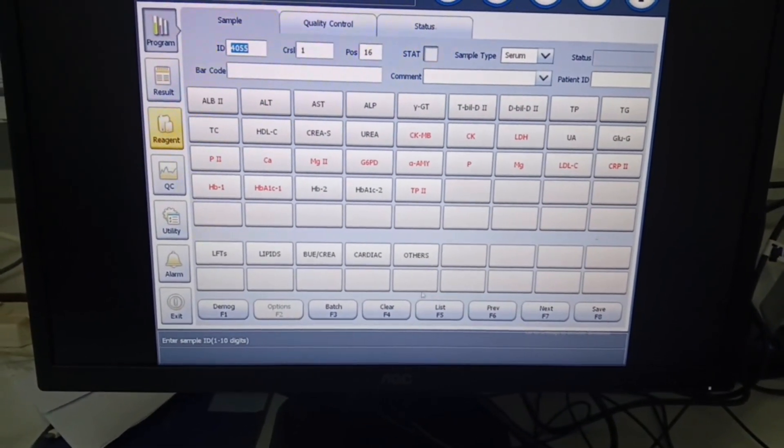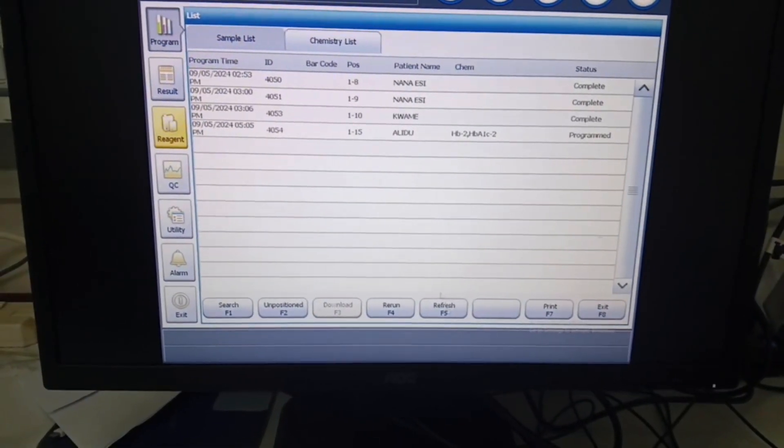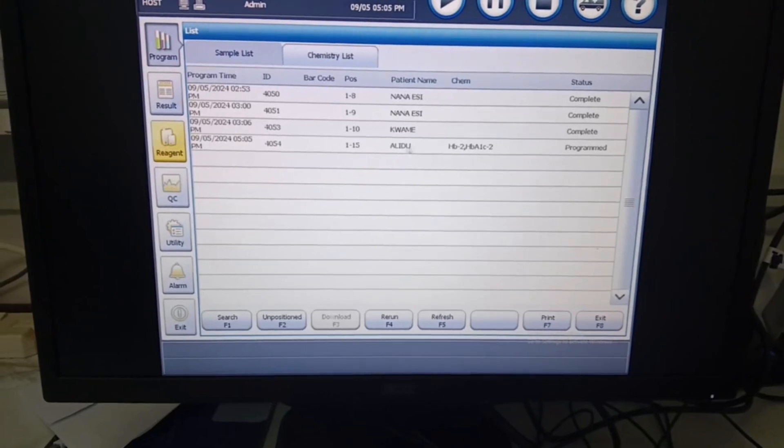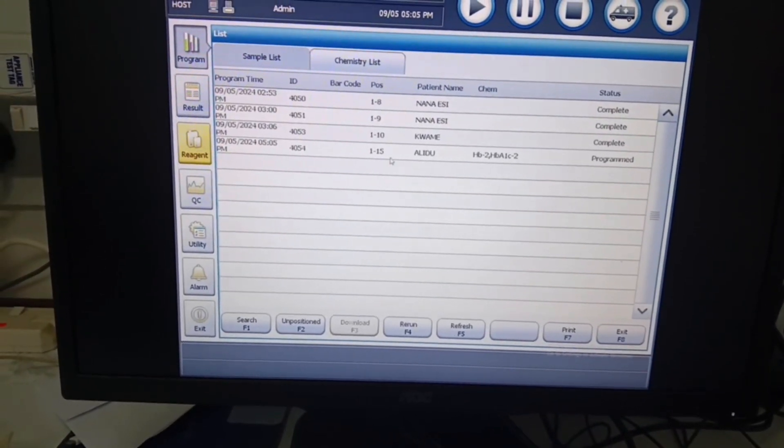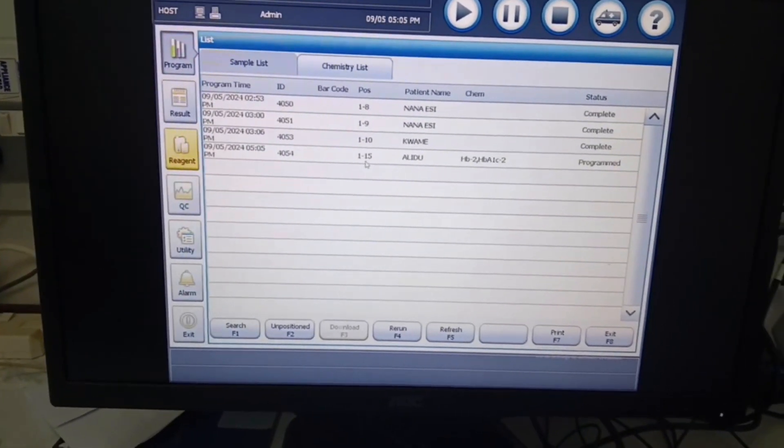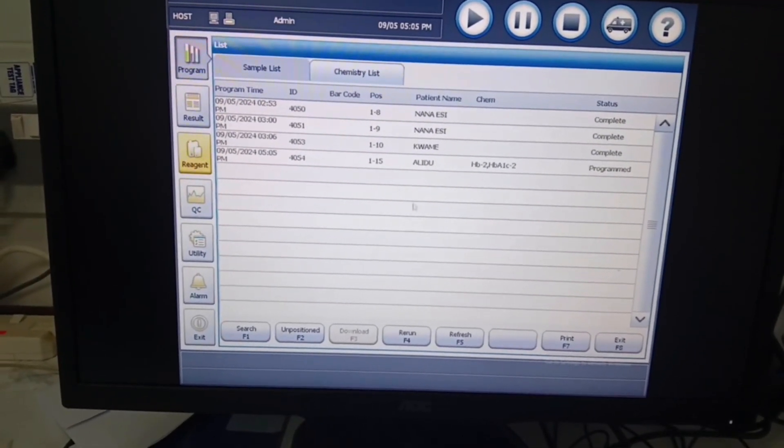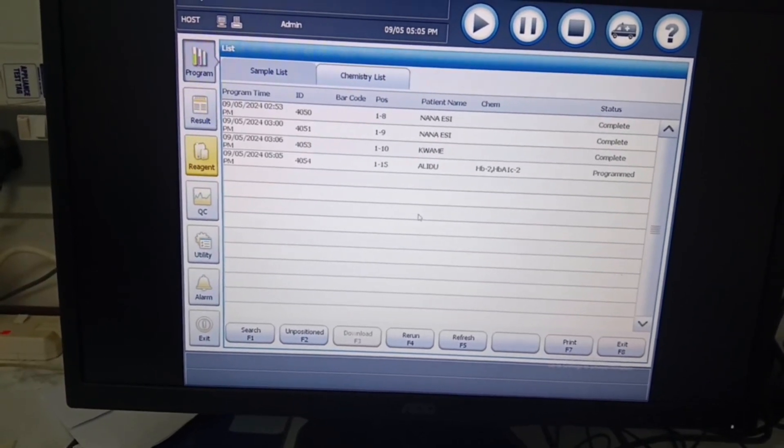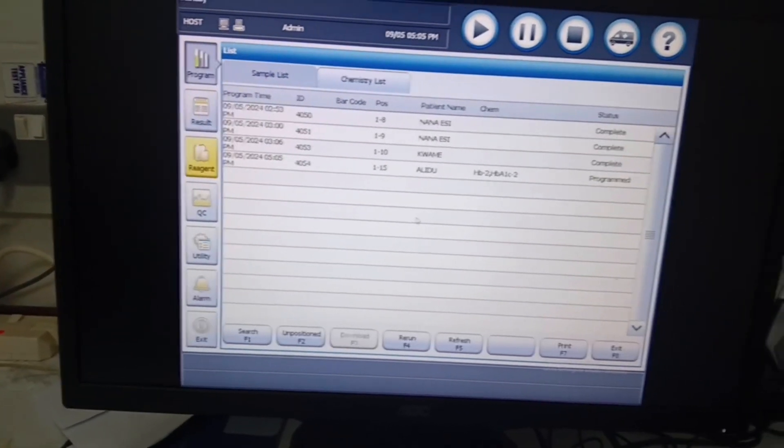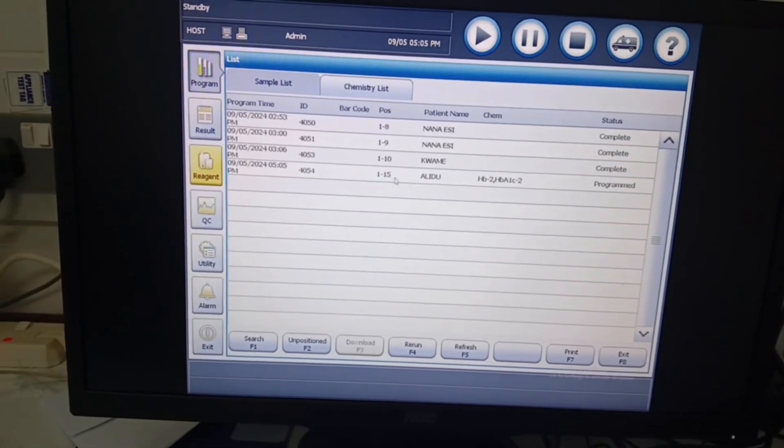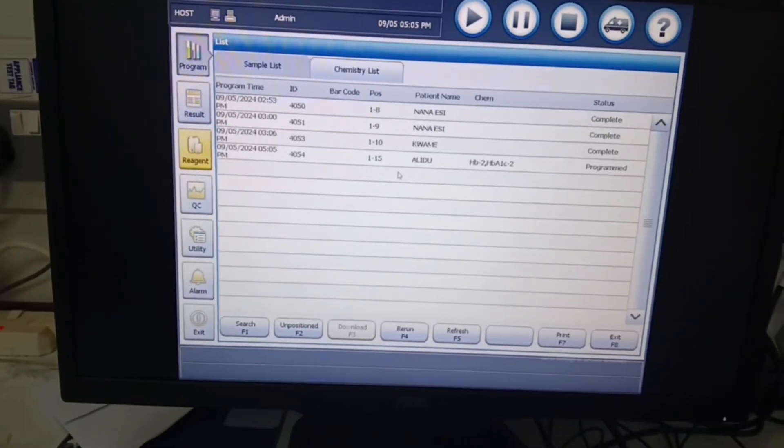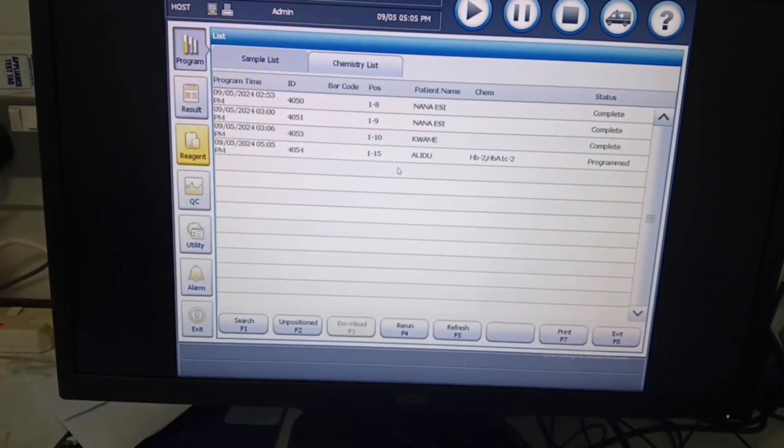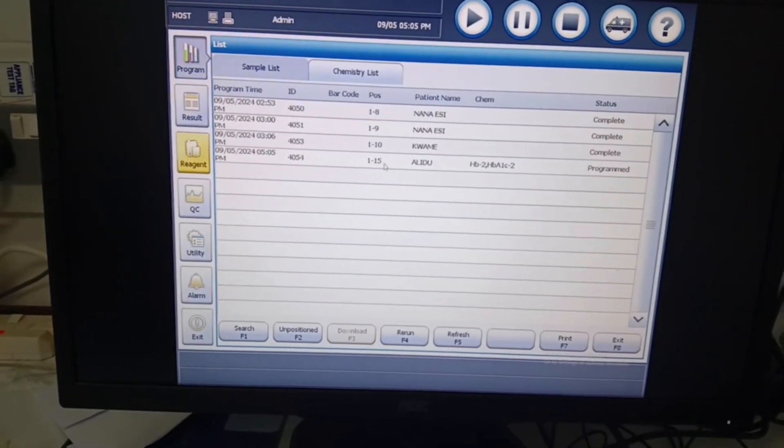Then we go to list F5. You see that we have Alidu here. The list gives us the details of all programmed samples we have and also tells us the position assigned to the sample. As we can see, Alidu is assigned position 15.